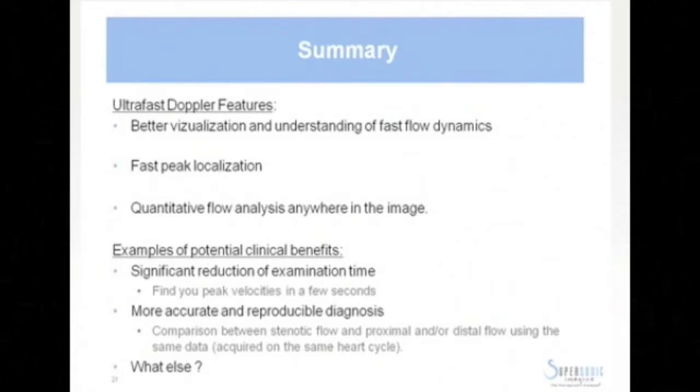For example, you could compare in a few seconds the stenotic flow with the proximal or the distal flow using the same data. So the data is acquired during the same heart cycle, and you don't have to move. Everything is stored, and you do your analysis from the same data. And after that, I'm sure we will find much more with more clinical experience.